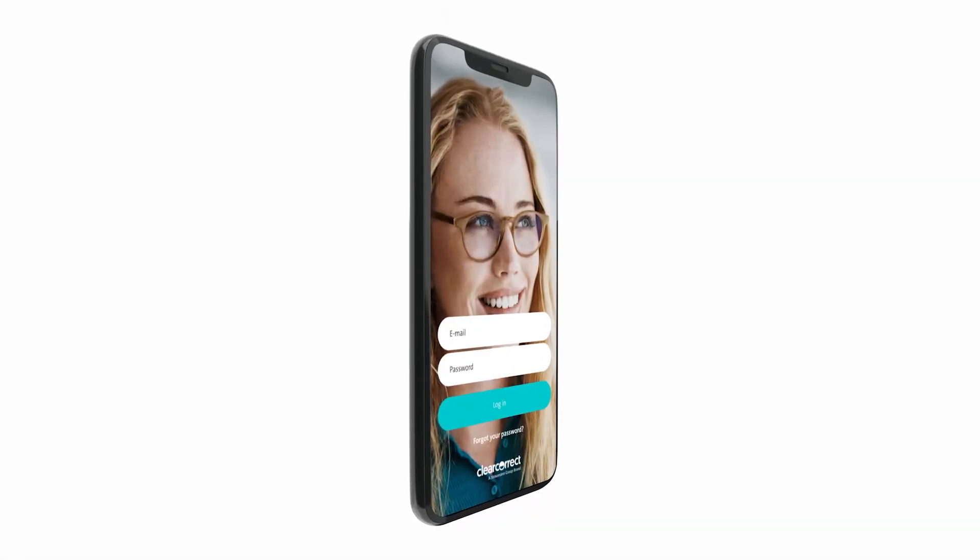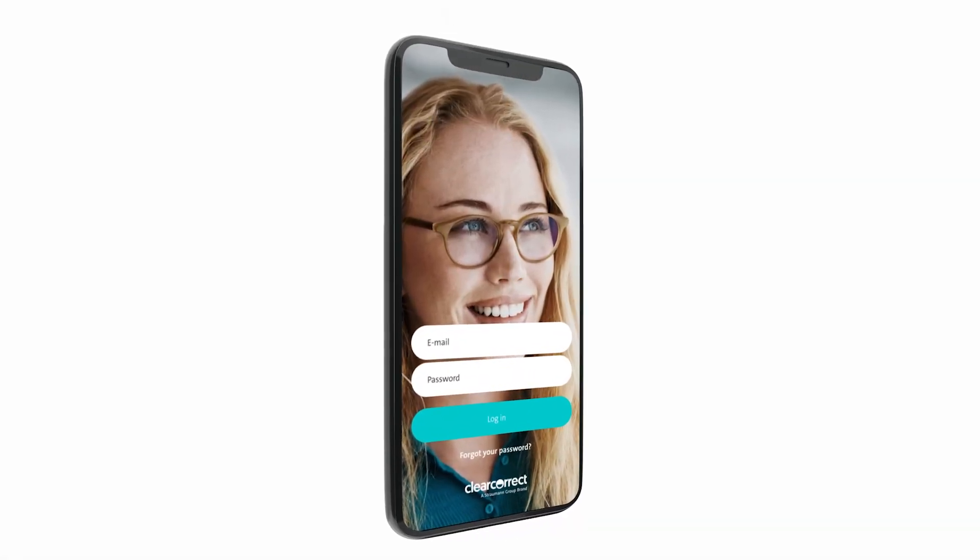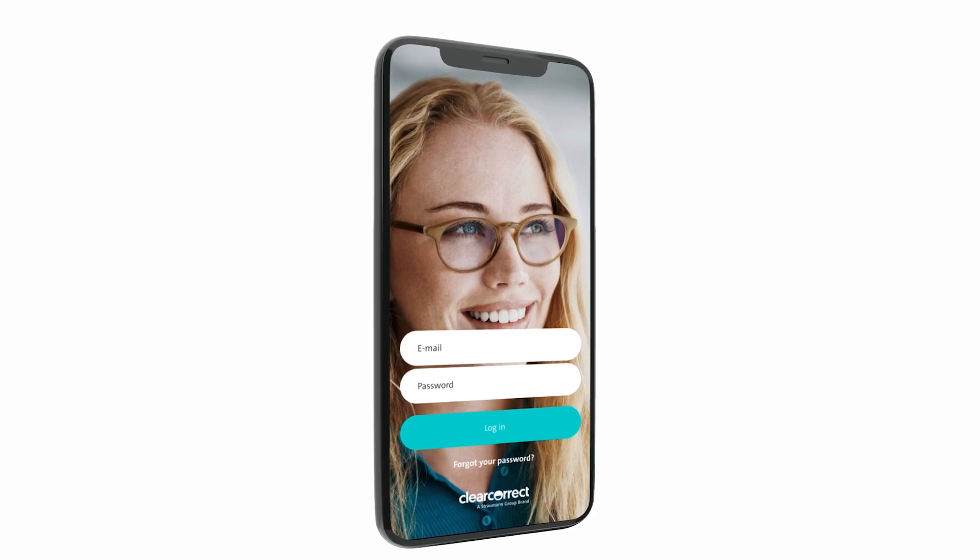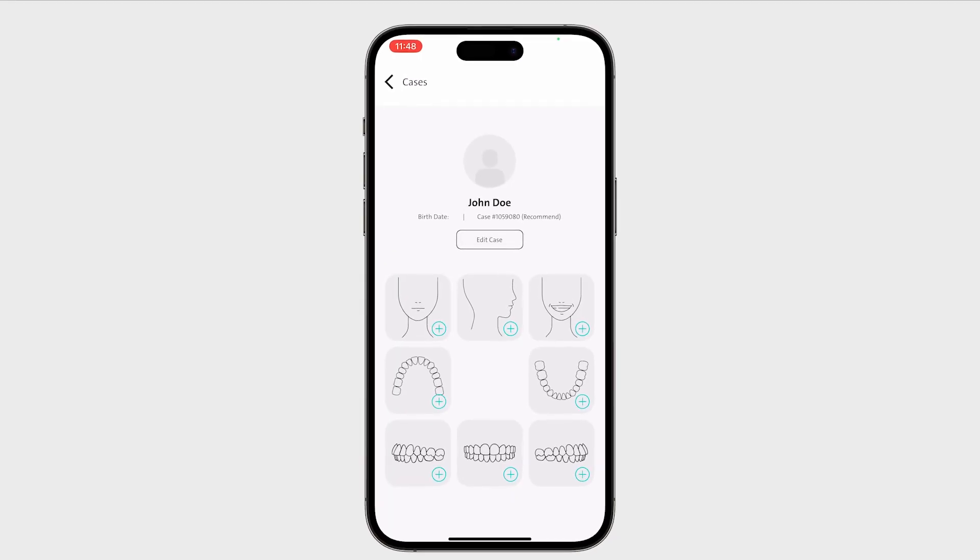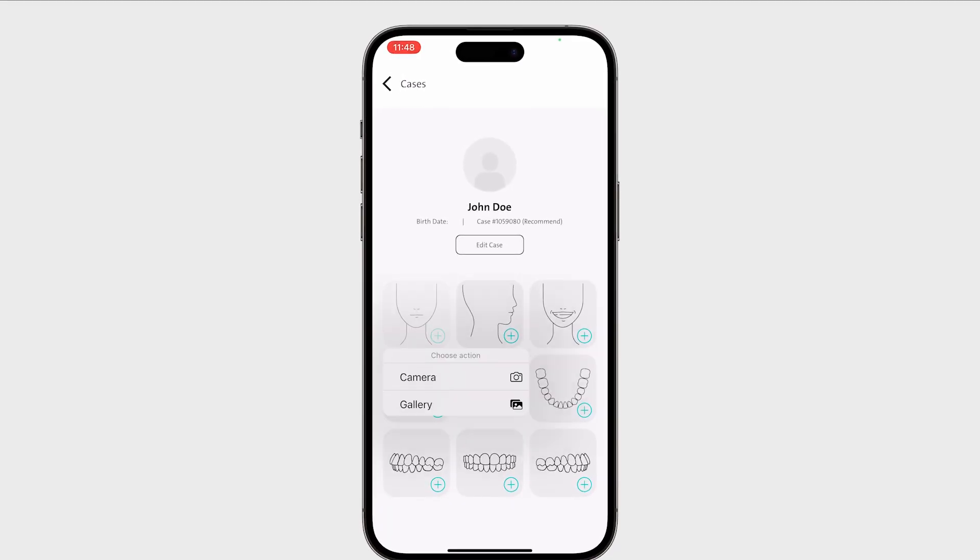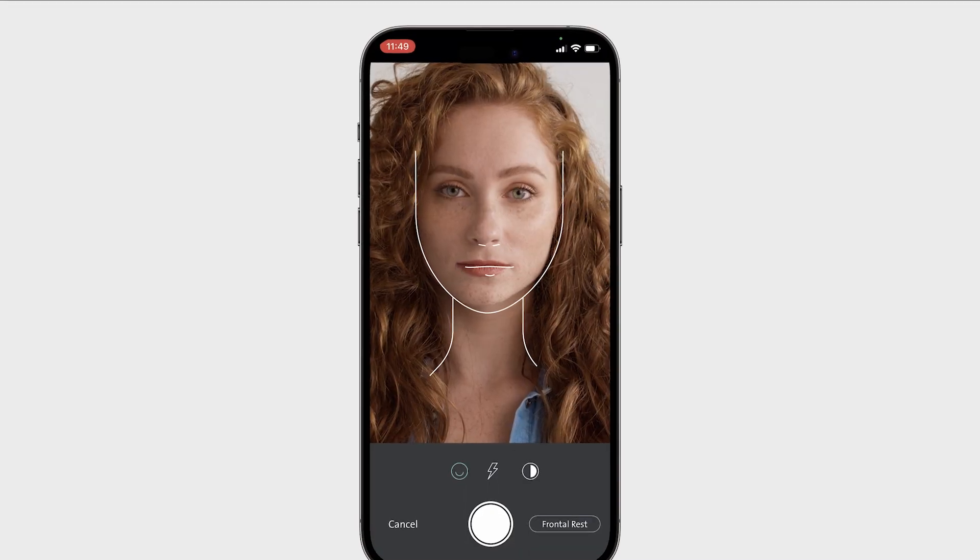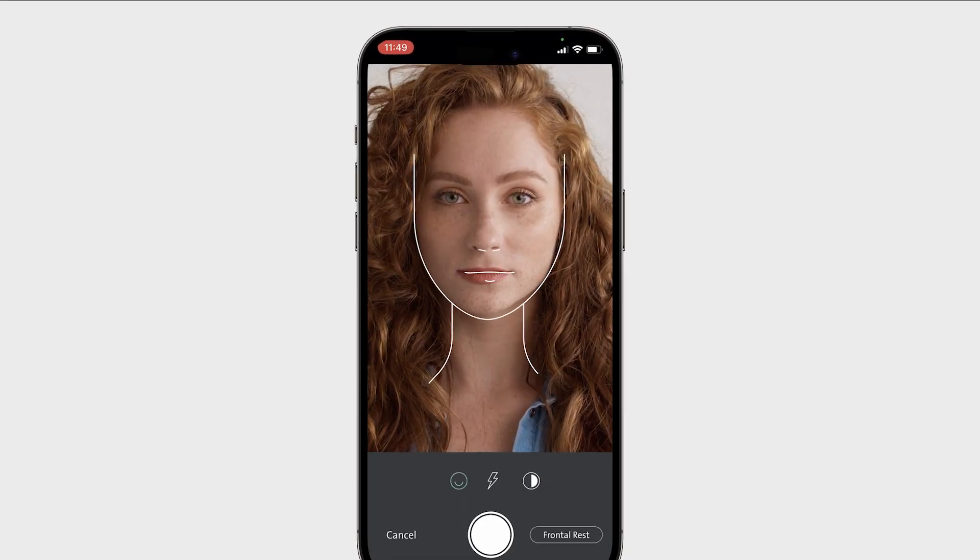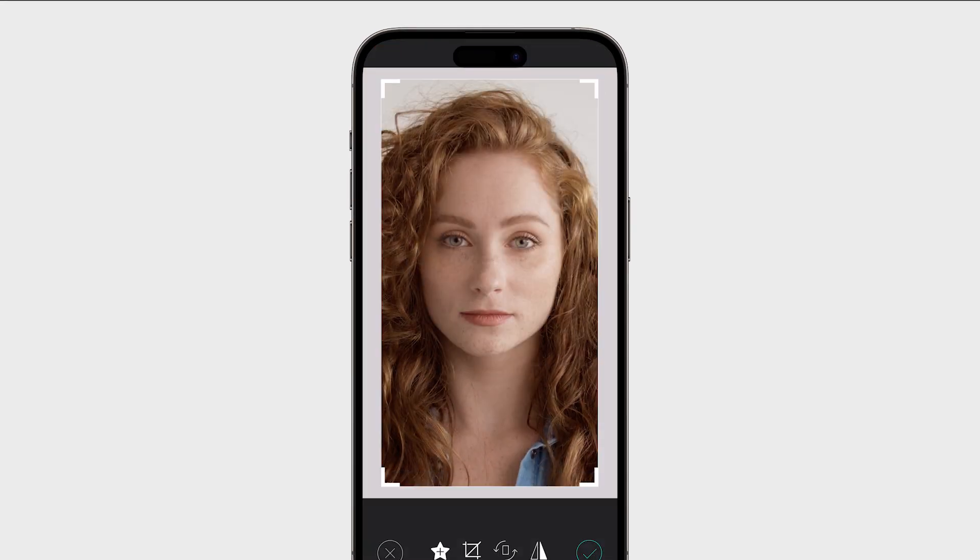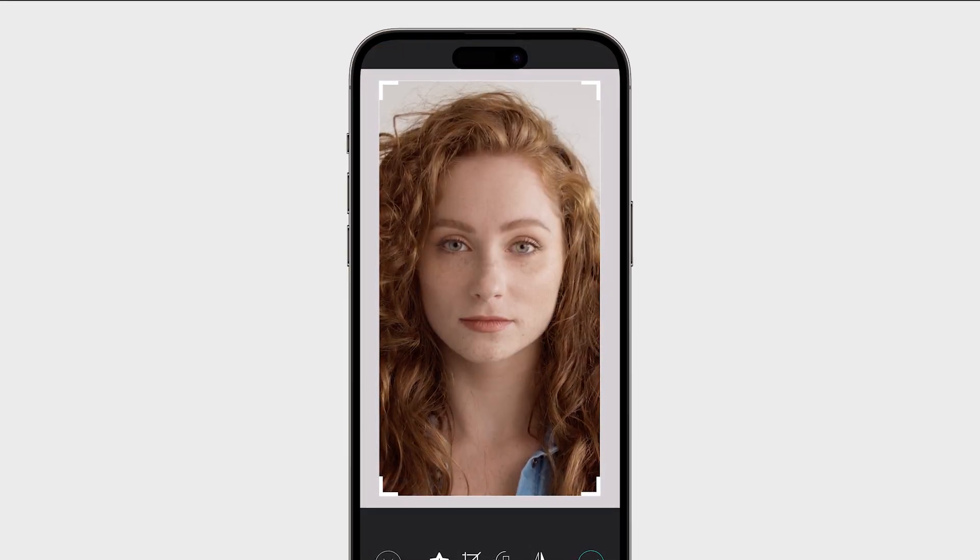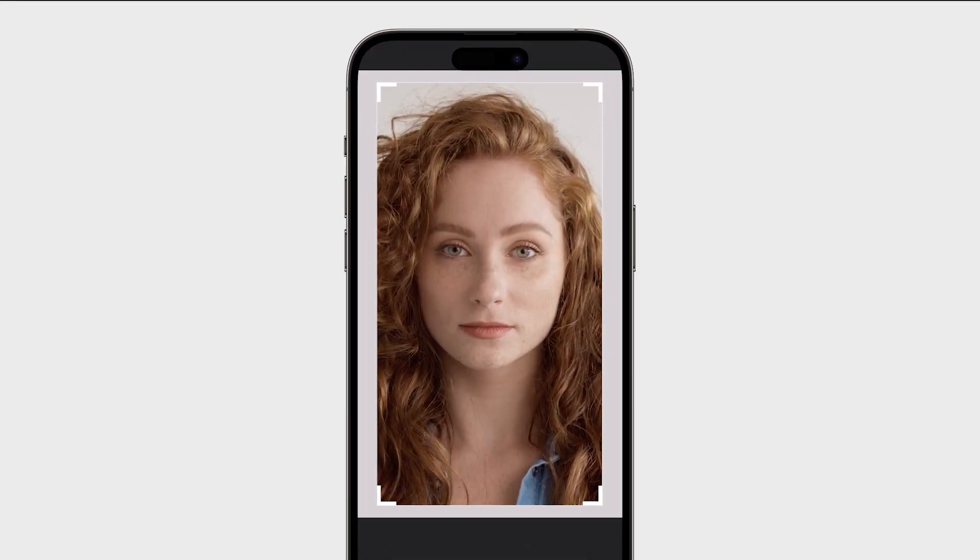After scanning, capture patient photos and add them to new case submission drafts quickly and easily with the ClearCorrect Sync mobile app. Using the app, you can take and edit patient photos and instantly upload them to the ClearCorrect doctor portal directly from your smartphone.